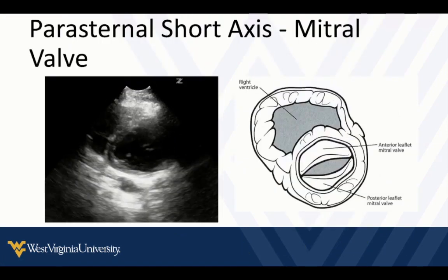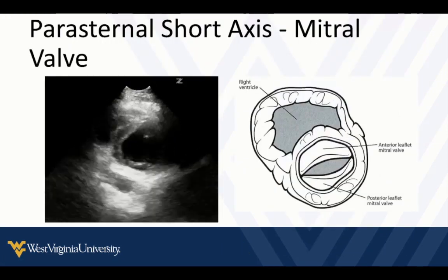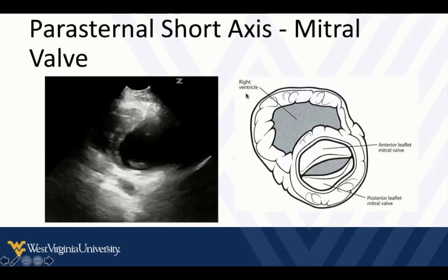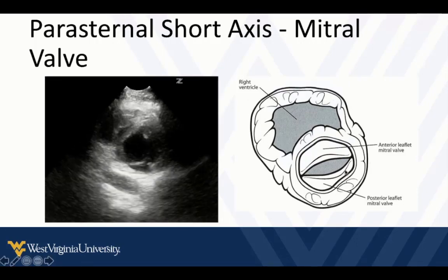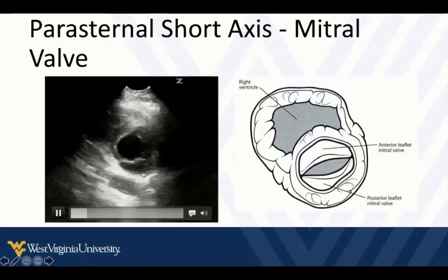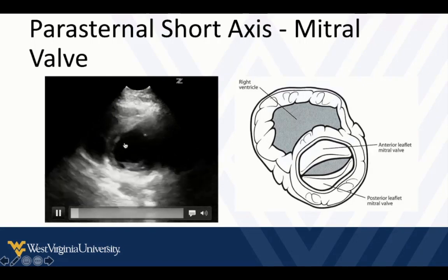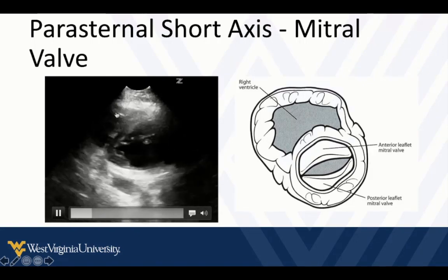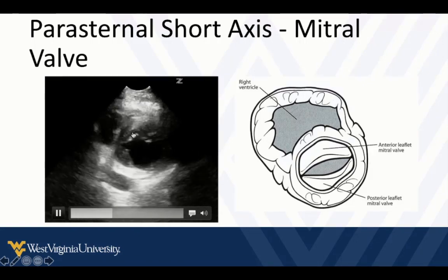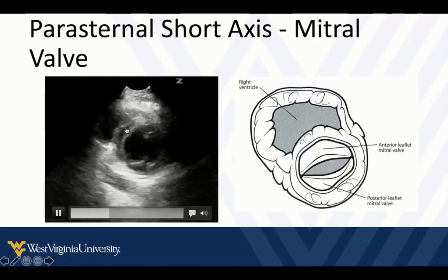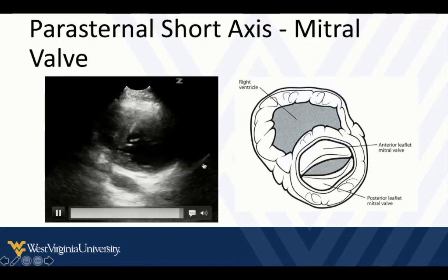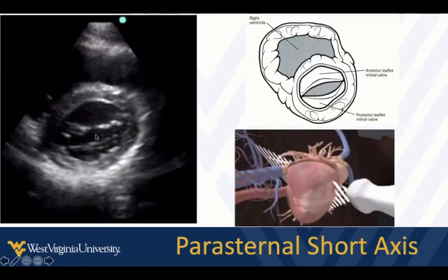From the aortic position, if we just slide a little bit away from the sternum, we should come out to where we see the mitral valve in cross section. You can see a much bigger diameter — we see muscular walls of the left ventricle and a fish mouth appearance. We see a little bit more of the right ventricle in the corner, but we should still see a nice round shape to the left ventricle and a rounded edge at the interventricular septum. Here in the still image is that fish mouth, nice round left ventricle.